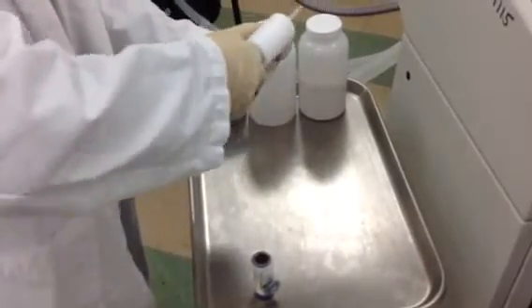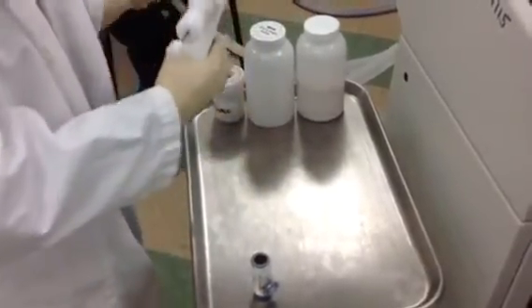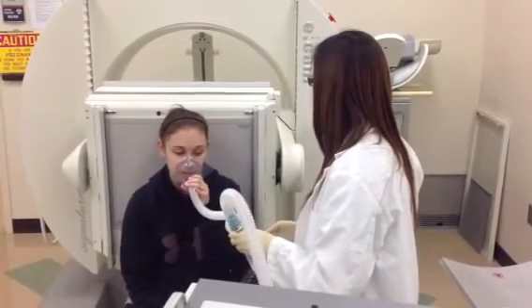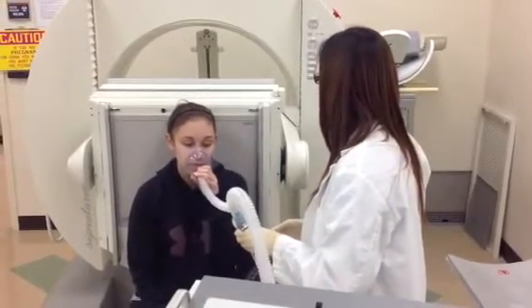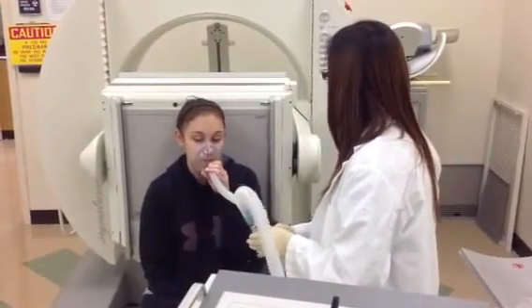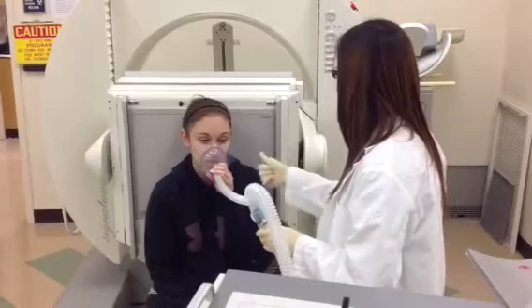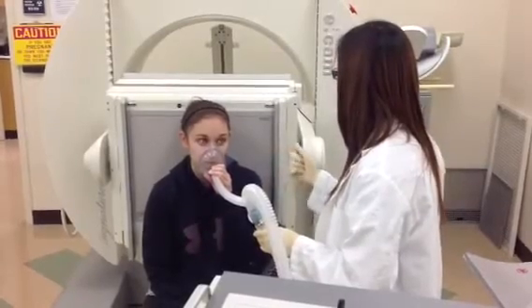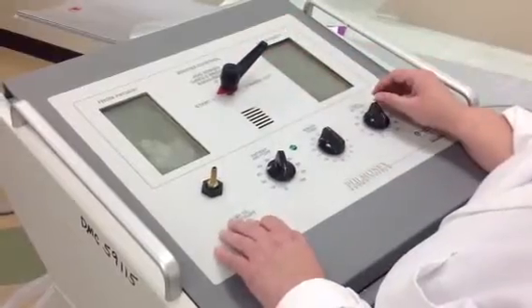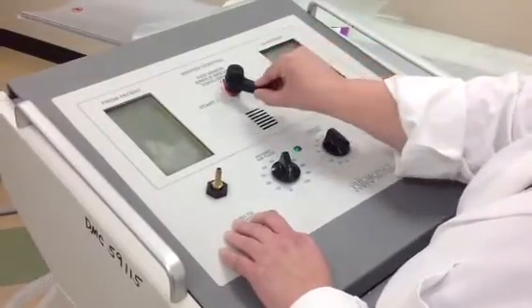Have the patient breathe normally. Carefully watch the front patient bag. If it starts blowing up, the patient is breathing too fast. Advise normalized breathing and increase the patient airflow speed. If the bag continues to expand up towards the glass, the patient will feel back pressure and resistance. To relieve this effect, increase trap airflow by turning the trap flow knob clockwise until the breathing bag deflates.